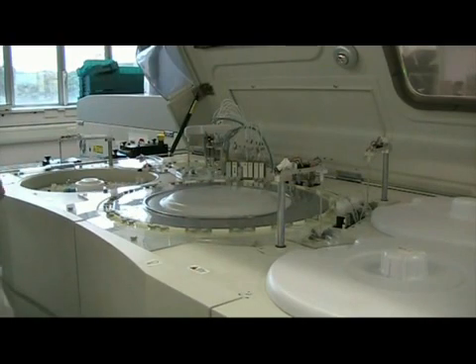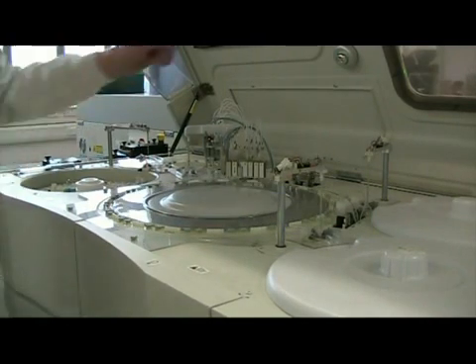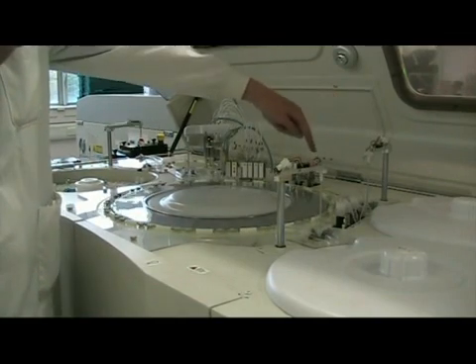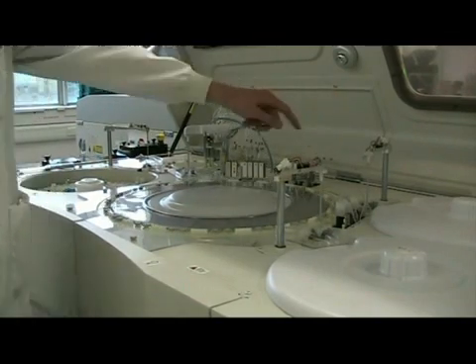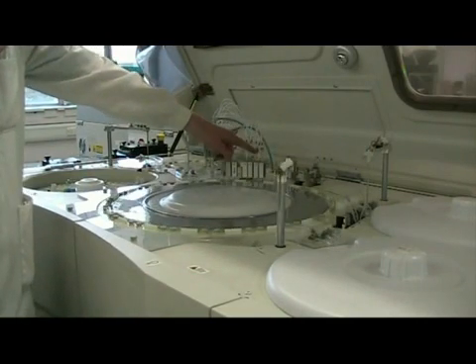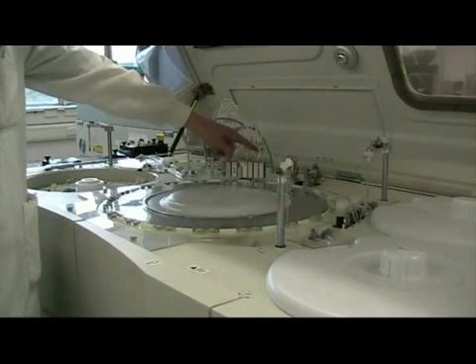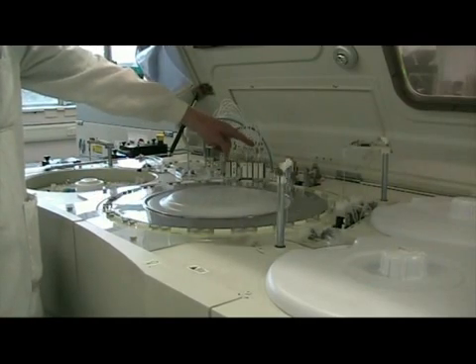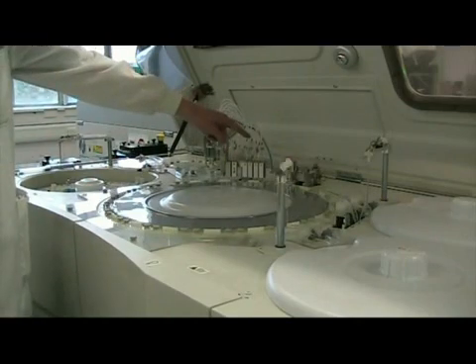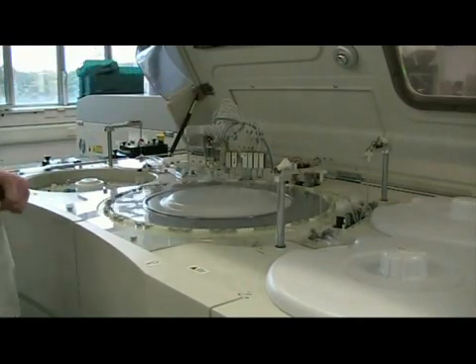After five minutes the sample will be in the right position for the reagent two probe to put reagent into the cuvette again. It then goes through mixing — we've got a mixer one and a mixer two here which come out and vibrate backwards and forwards and spin around very quickly in the cuvette. You can see that now — that ensures that the sample is mixed effectively.